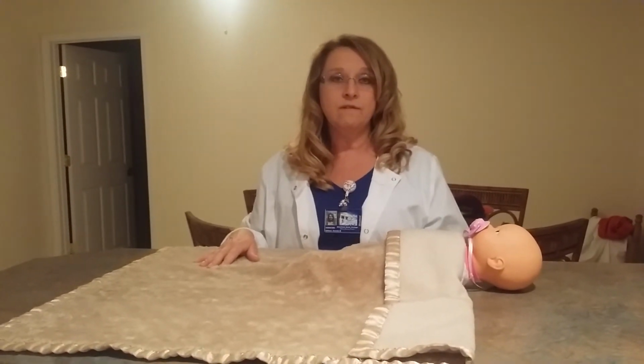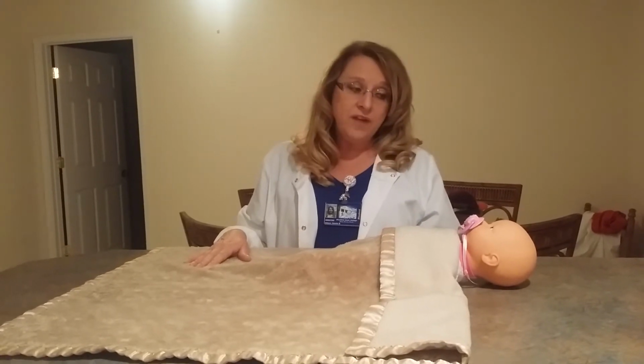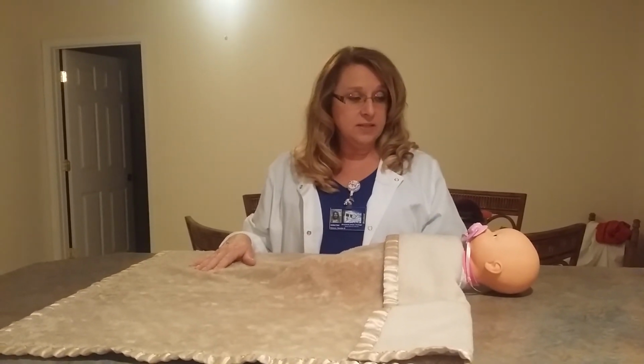Patient teaching includes informing the patient that he or she may develop some urinary incontinence, urgency, frequency, dysuria, discomfort, or urinary retention after the Foley has been removed. Please notify me if any of these symptoms happen.